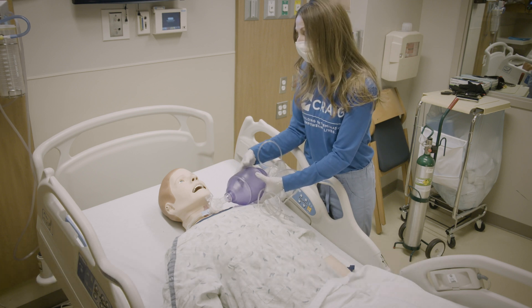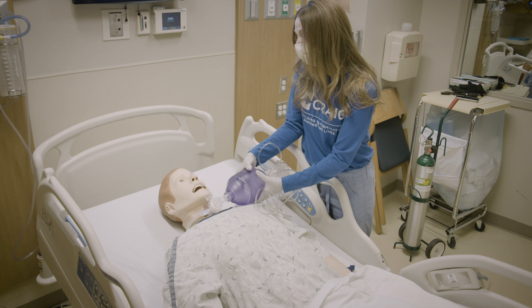As you are breathing for the patient, check in with the person to make sure they are responsive. If they are not, call 911.